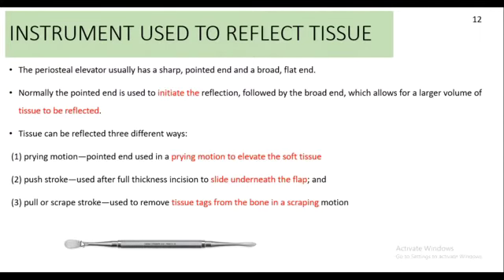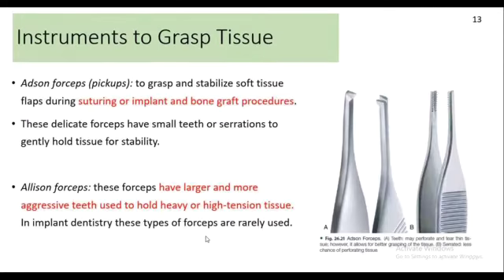Push is used after the full thickness incision to slide underneath the flap, or also pull or a scrape stroke, which is used to remove the tissue tags from the bone.